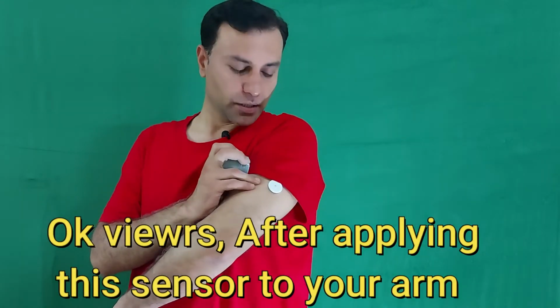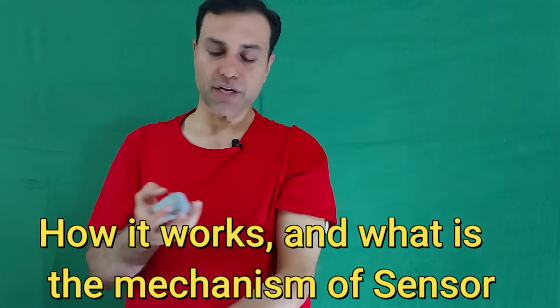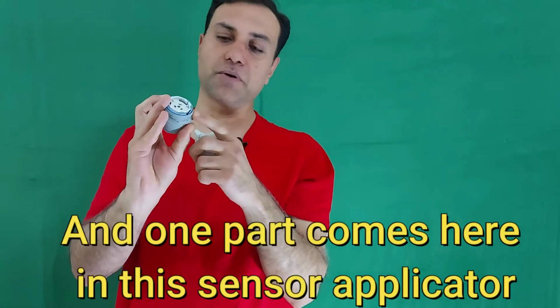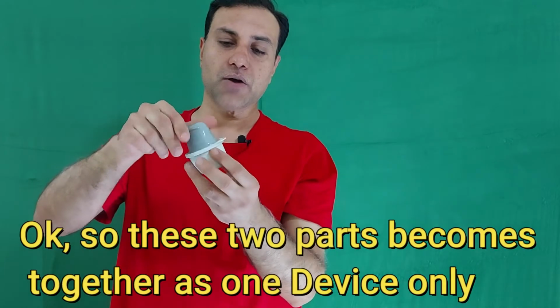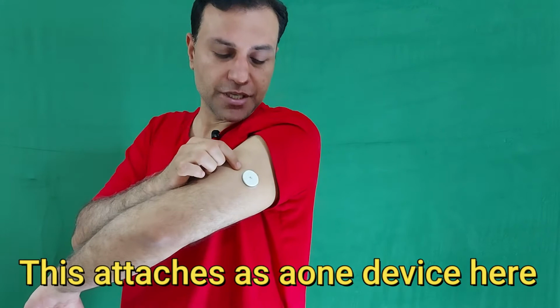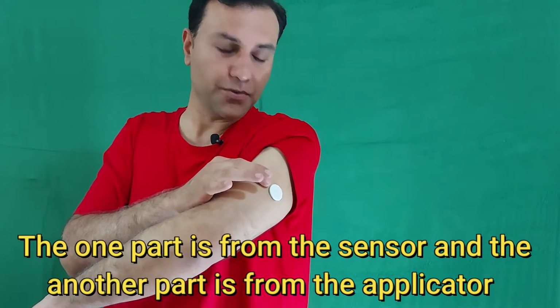Okay viewers, after applying this sensor to your arm, as you can see, I will explain the sensor, how it works and what is the mechanism actually of this sensor. This is the sensor pack and this is the applicator. The sensor actually comes in two parts. One comes in this sensor pack and one part comes here in this sensor applicator. When you combine them, these two parts become together as one device only. When you apply it here, this is one device, but it consists of actually two parts. One is from the sensor pack and the other part is from the applicator.